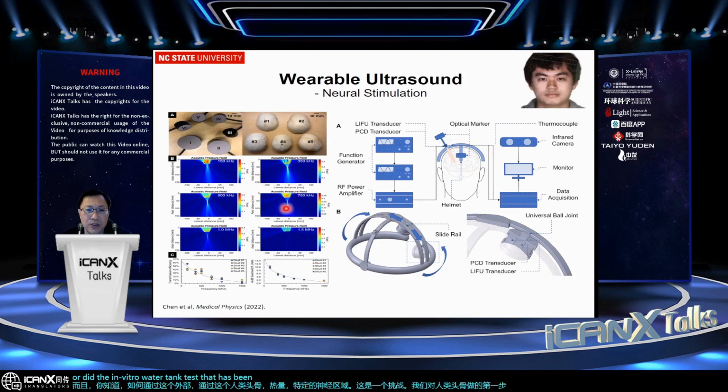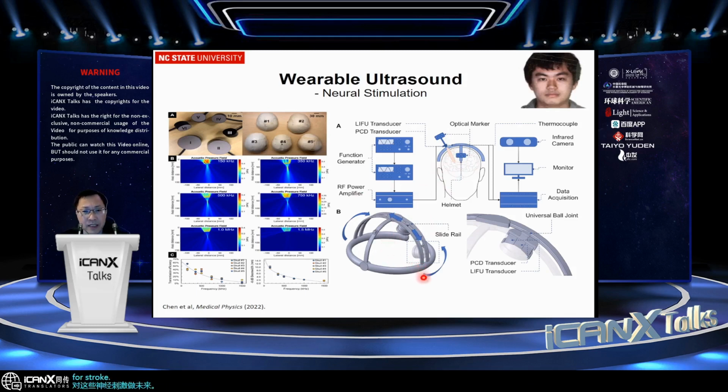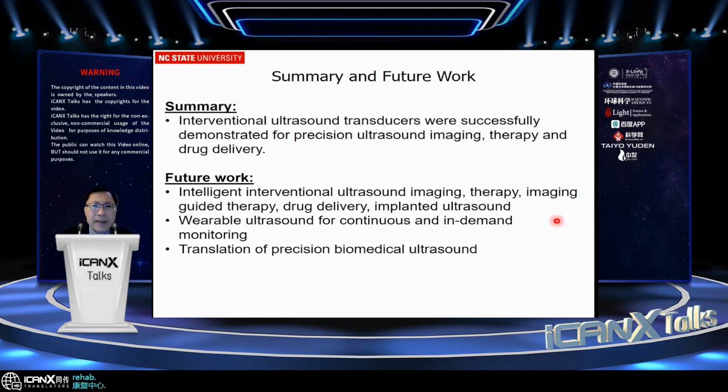The first step we did with the human skull was the in vitro water tank test. That has been very successful in helping us design this wearable ultrasound for future neural stimulation for stroke patient rehab. All right, so this is a quick summary here.